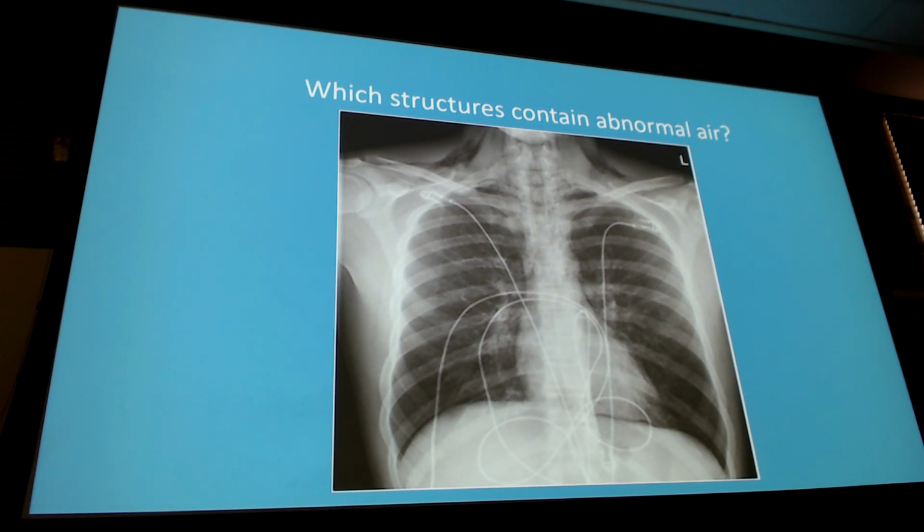And that's going to be my secondary sign of, I see air around the pericardium. Is it a pneumomediastinum or not? I can use my continuous diaphragm sign, but even if that's not there, it's kind of hard to make out. Do I have subcutaneous emphysema? Because if I do, I'm probably having a pneumomediastinum, and I'm going to go with that because the air had to go somewhere. How did that air get there? Pericardium into the mediastinum, up into the subcutaneous tissue.